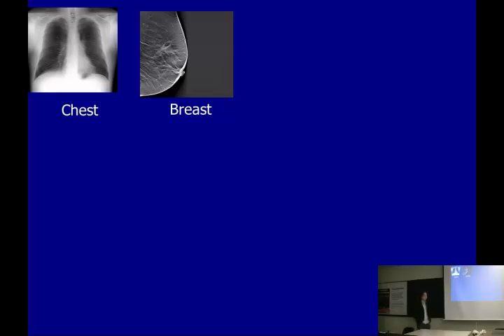And now we show some promising fields of tomosynthesis. Some of them scientists are investigating, some of them are still very new, and only a few groups are working on them. Chest imaging is the first tomosynthesis field that people investigated, and the device has been commercially available from GE Healthcare since 2008. Second, breast imaging. Many manufacturers are working on that, and a single company got FDA approval in 2010. But many other companies are still doing clinical trials or research to try to get approval.